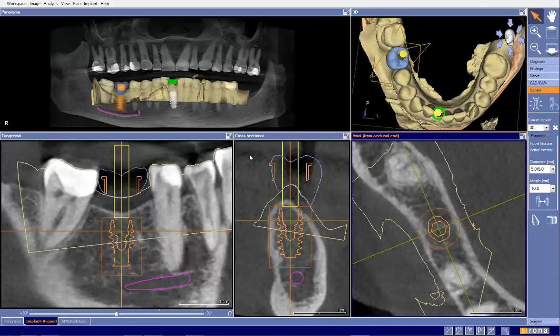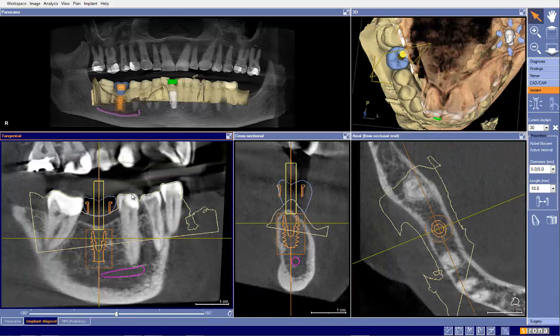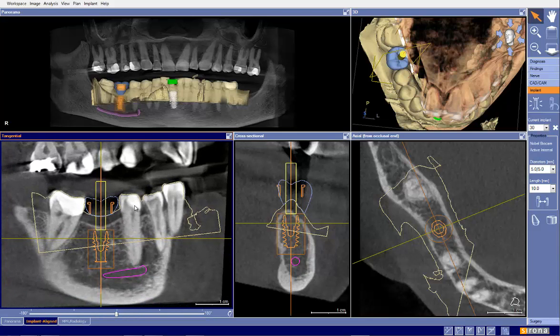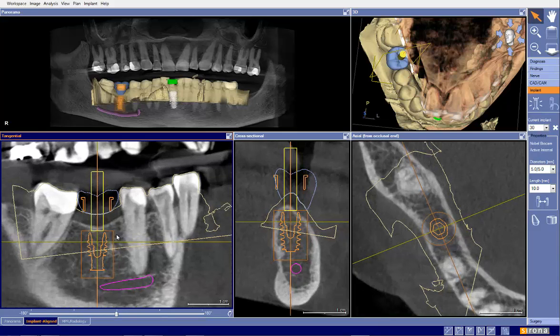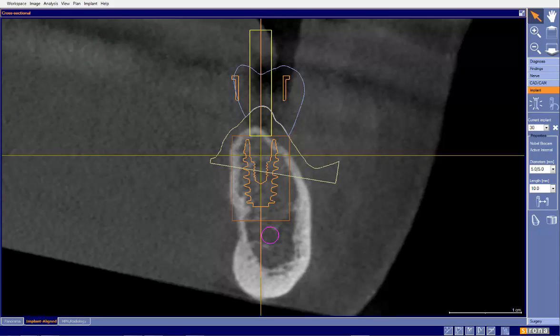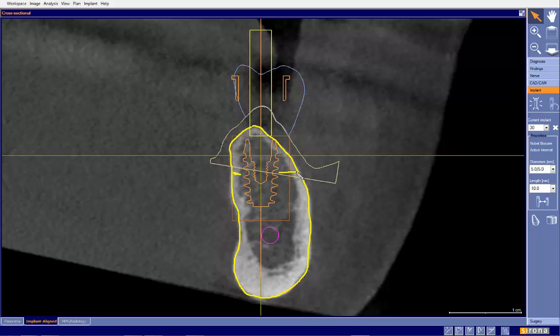Let's go ahead and take a look at our implant plan. I look at everything from a practical approach in a step-by-step fashion. My first thing is mesiodistal position — it looks very good, well-centered between the teeth. Now let's look at the buccal-lingual position. We'll let this line represent the outline of our bone here.